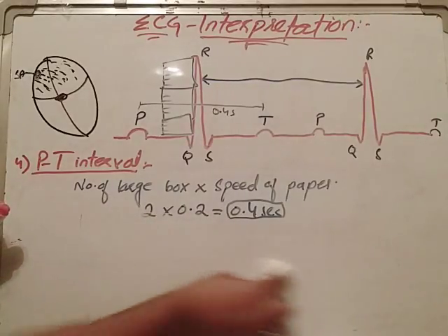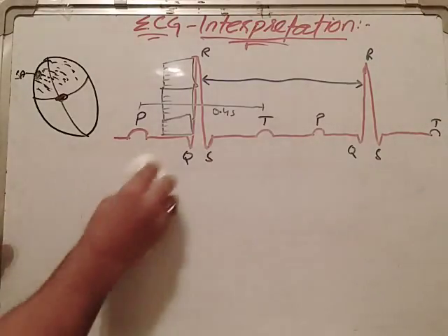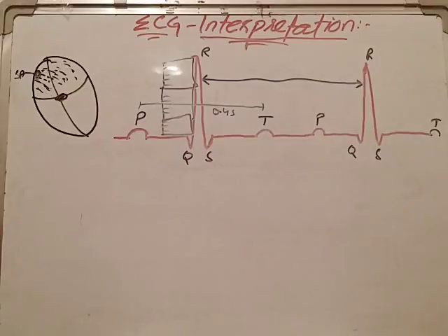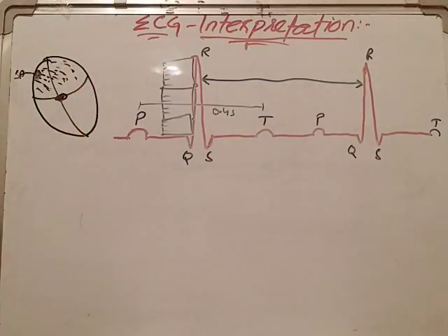The next is the axis of the heart. Different persons, that is asthenic, hypersthenic, hyposthenic, have different orientations of their hearts, different axes. If the person is asthenic, the heart will be more vertical in position. If the person is hypersthenic, or fat, the heart will be tilted horizontally. So different persons have different orientations of their heart.